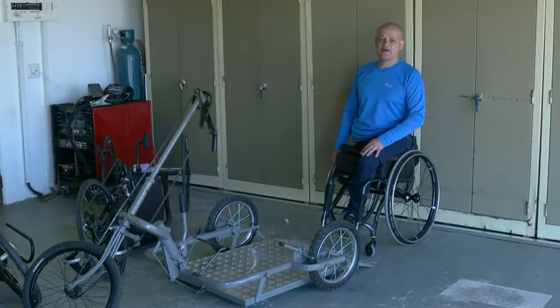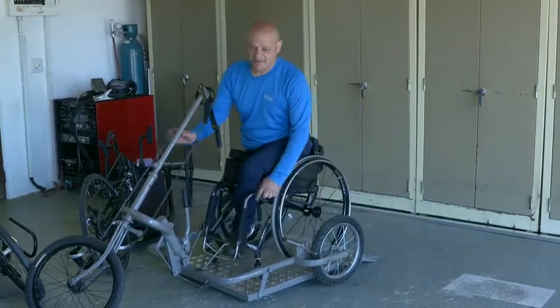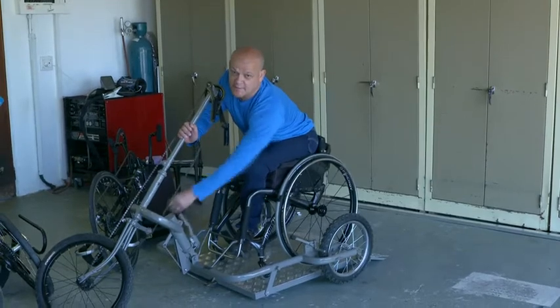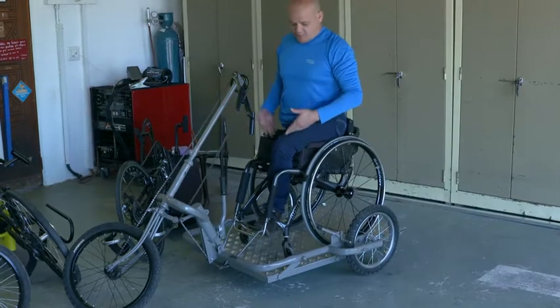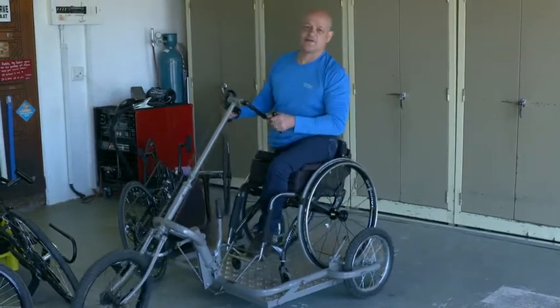So this is the second model of the Rural Handbike, and it actually works like this. You get onto the bike, you lock it and then you just lift your floor. So now you stay in your own wheelchair, you can pedal from your own wheelchair, you unlock it and you're ready to go.